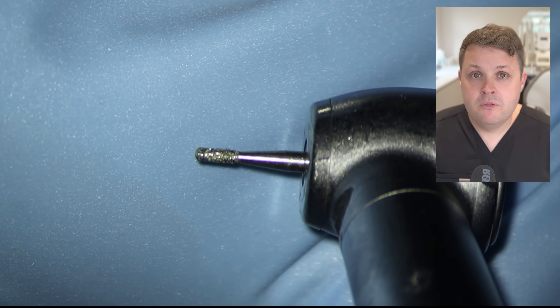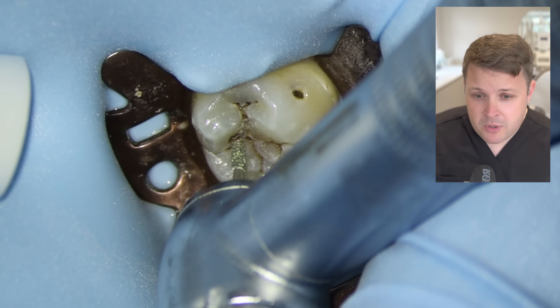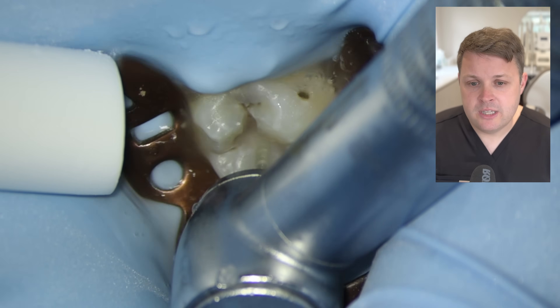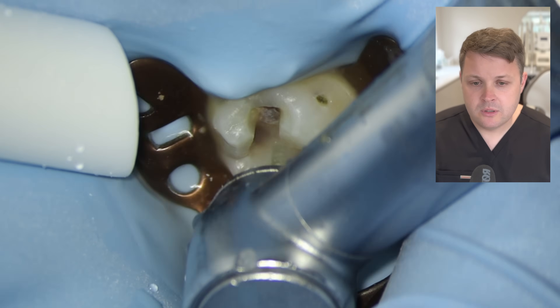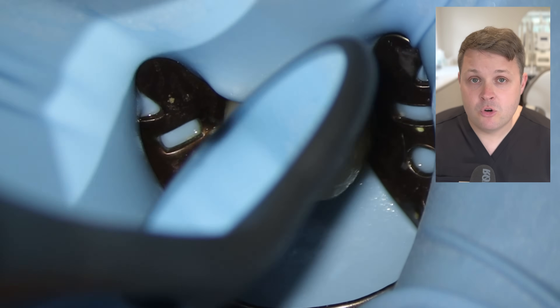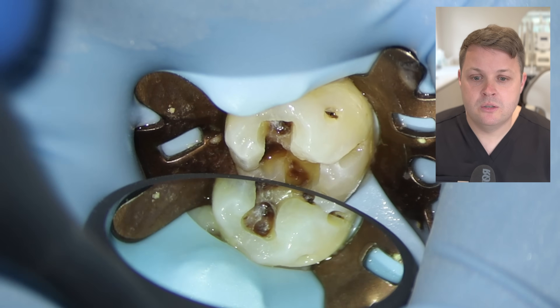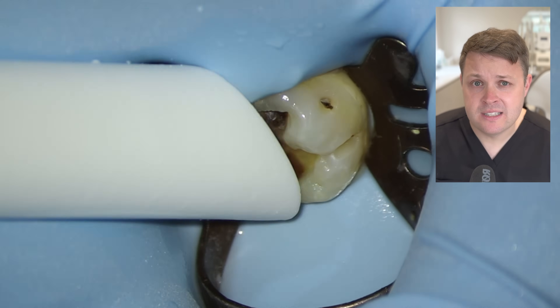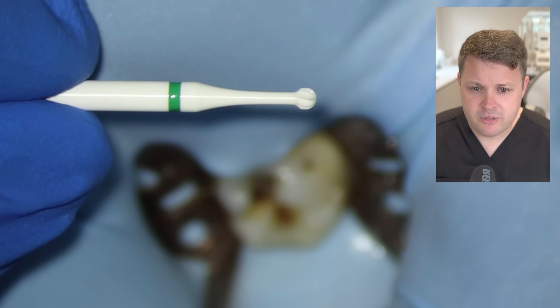We're going to remove the unsupported enamel. I'm going to use a fissure burr — sometimes I like a pear-shaped burr, but in this case a fissure burr. I'm cutting into the enamel and removing the decay incrementally: remove some enamel, have a look, remove a bit more. The problem is the fast handpiece can't distinguish between sound tooth tissue and decayed tissue, so you've got to be really careful.